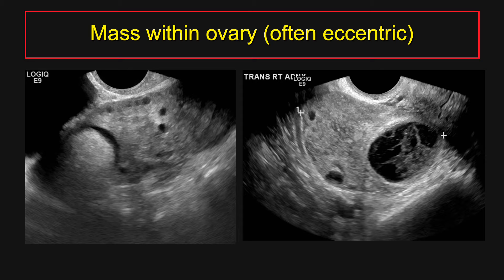Another important morphologic feature is the presence of a mass or cyst within the ovary, which is often eccentric and serves as a lead point, causing the ovary to twist on the vascular pedicle. These are two separate cases of ovarian torsion proven at surgery. On the left image, you can see an echogenic mass with posterior shadowing eccentrically located within the ovary with stromal edema and peripheralization of the follicles — a dermoid cyst leading to torsion. On the right image, an enlarged ovary with stromal edema and a lead point hemorrhagic corpus luteal cyst leading to torsion.